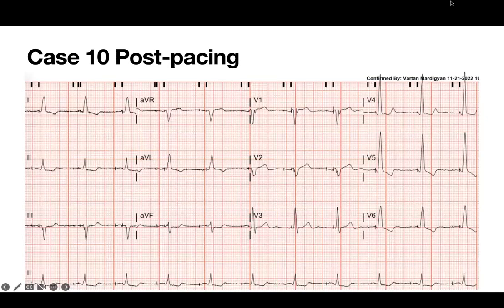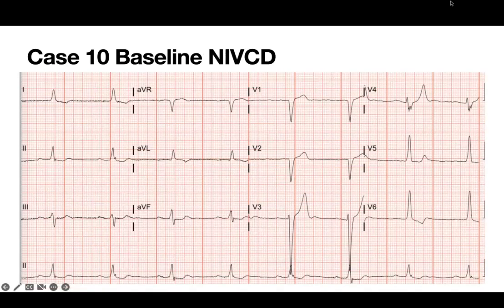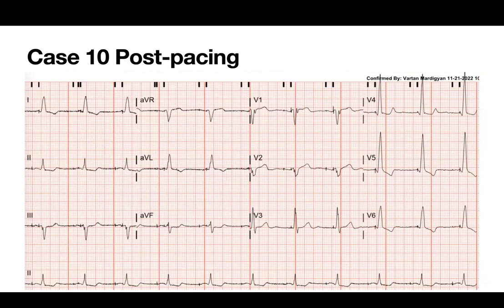Can you show us his baseline ECG for this case? Yeah, there it is. Interesting, the Q in the lateral precordial leads. I wasn't sure where that comes from. He has a previous MI, a previous lateral MI. He has an occluded OM, and his EF was about 50. Unipolar pacing from the tip did not make any difference, even with higher output. Everything was unipolar when I was testing. It's just that the final programming here is bipolar, but it was the same. The morphology didn't change afterwards.